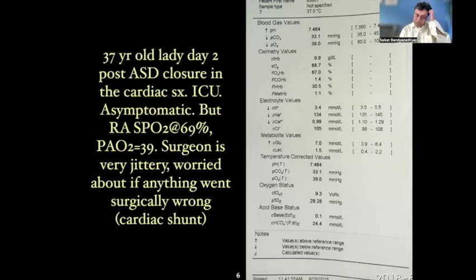To start with, we'll have two clinical scenarios. The first one is a 37-year-old lady who is on day 2 in the post-operative ICU, post closure of a simple ostium secundum ASD. There was a patch closure, and there was a young surgeon. While he was closing, on ultrasound we saw a small leak in the patch close to the site where the IVC cannula was in.